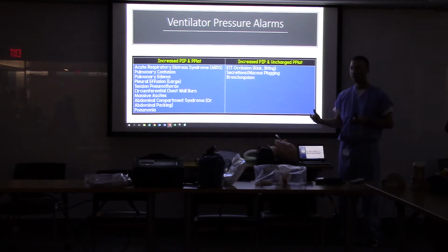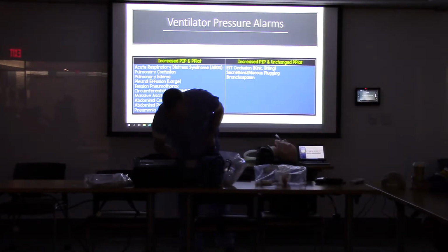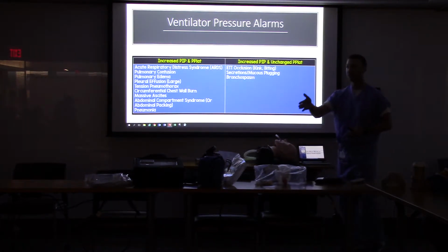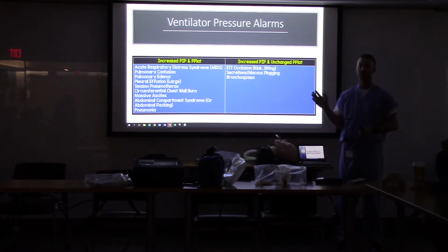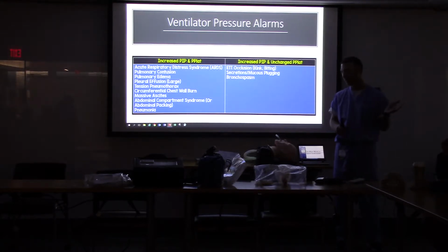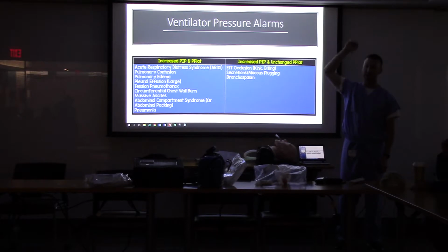Well, the vent at baseline, which when we turn this on, it doesn't say on the outside. It'll say, let's say the pressure alarm is at 50. So if the pressure in the chest is anything above 50, the vent won't deliver a breath, and it'll just keep alarming at you. And the patient will not get a single breath until you do one of two things: either fix the asthma, which is not going to happen right away, or you have to raise the vent alarm higher just to get a breath in.